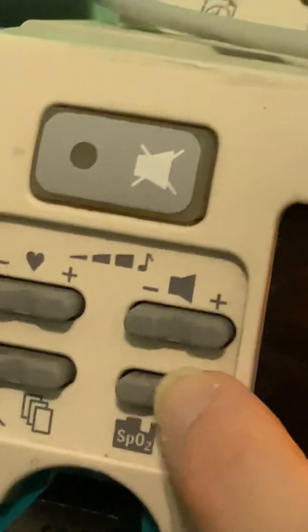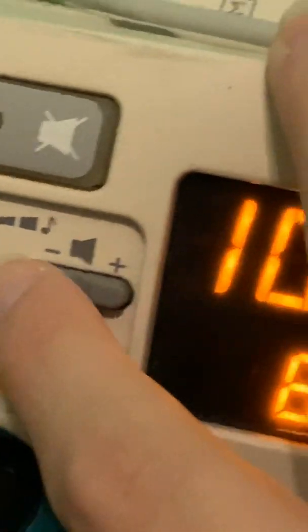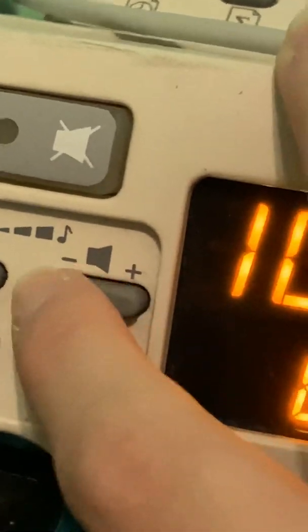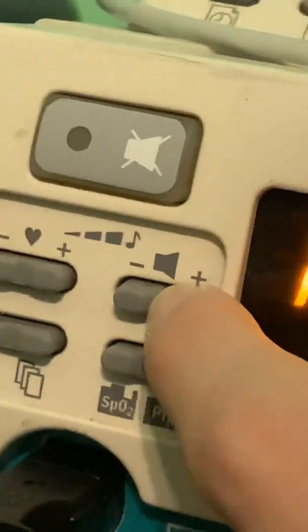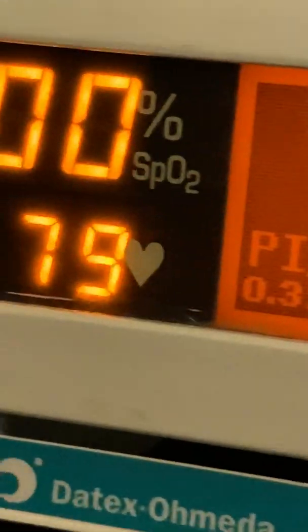This is how I adjust the alarm volume. This is how you adjust the alarm volume — we always set it at high. And this is how you adjust the pulse volume, which is what beeps to your pulse.